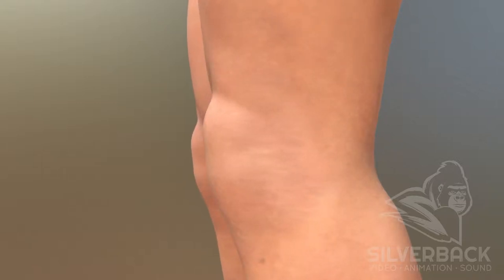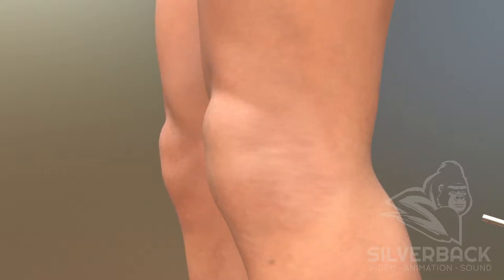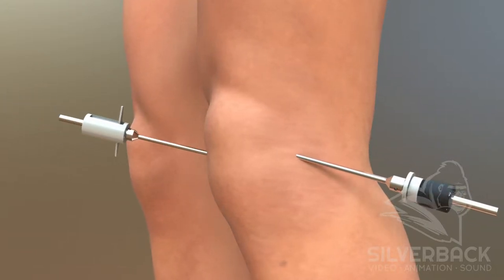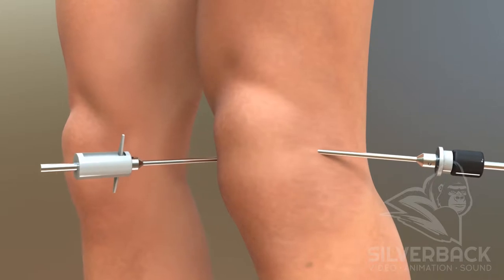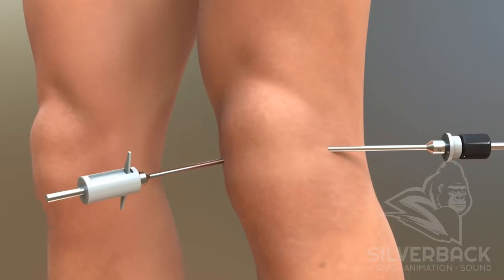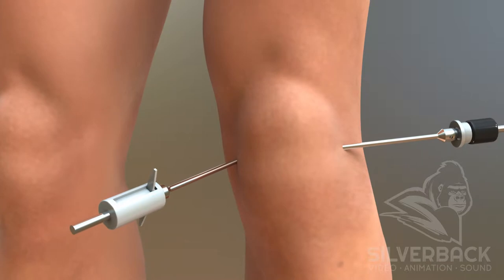Knee arthroscopy is surgery using small surgical instruments that allows your orthopedic surgeon to examine your knee without open surgery. Your surgeon can also fix many of the common problems of the knee joint during this procedure.